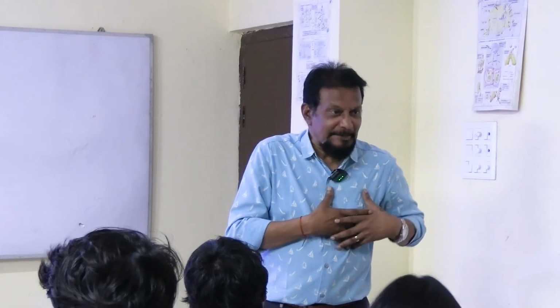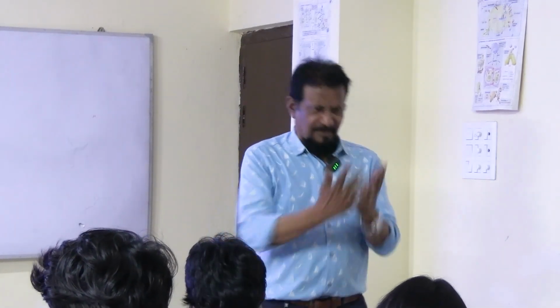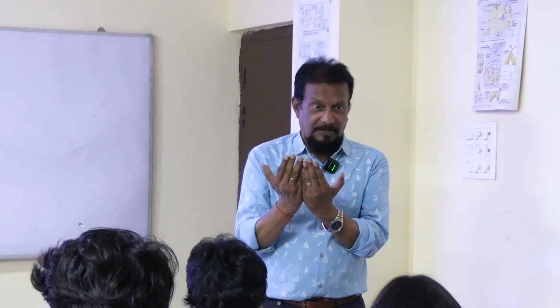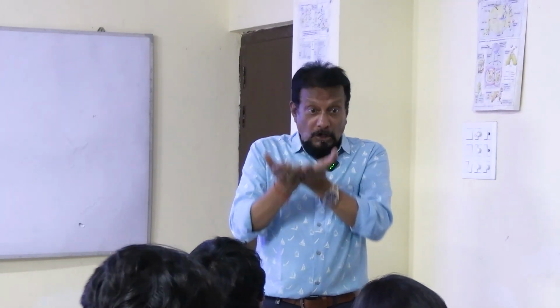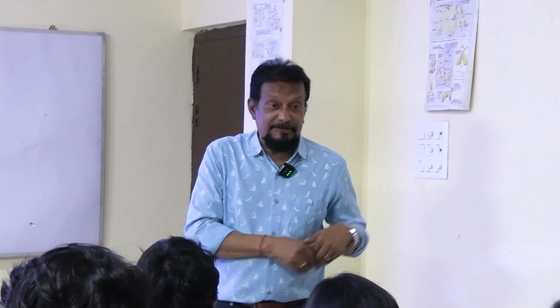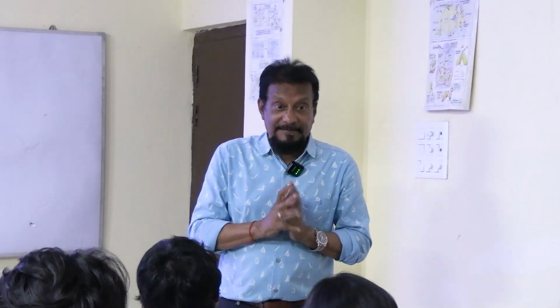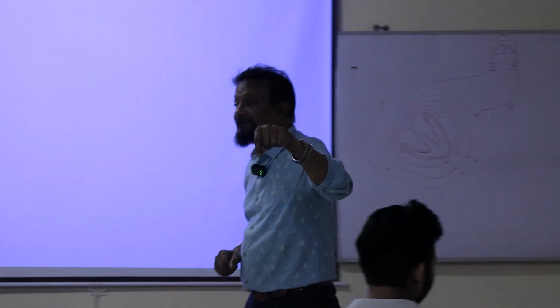So whether there is any ischemia, go for an ECG, electrocardiogram, and you see the ST segment, whether it is elevated or it is depressed. In case of acute myocardial ischemia, there will always be depression in the ST segment.